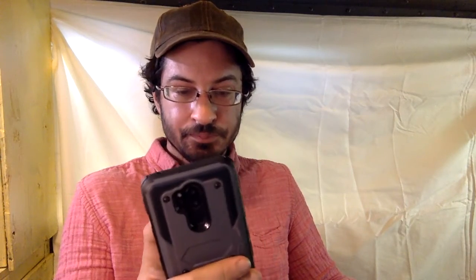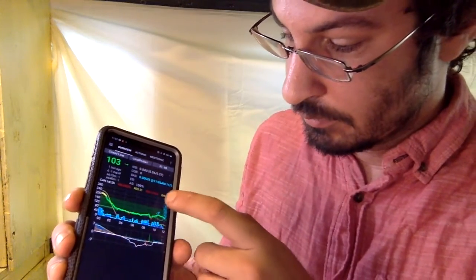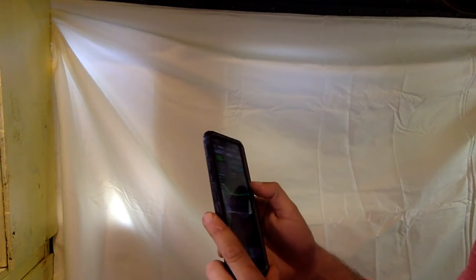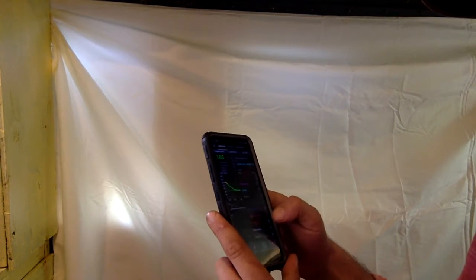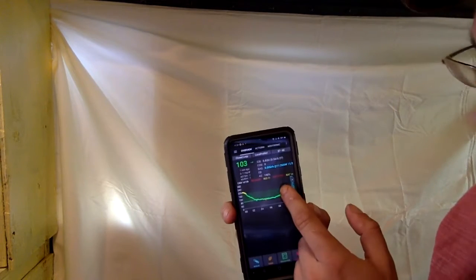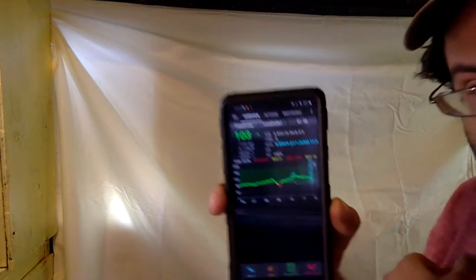Okay, so let's go to our graphs. You guys will be talking to a phone here. I'm going to take off some of the settings. We can walk through those. And there's no way for me to pause my recording here, so forgive me. Alright, so here's my graph. I hold this if I want to change the duration. So we'll just use this very short time of the last 5 hours.